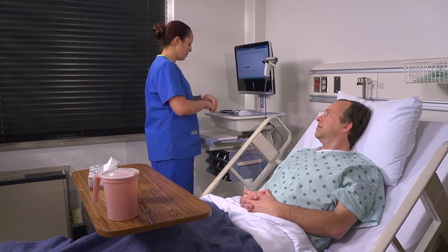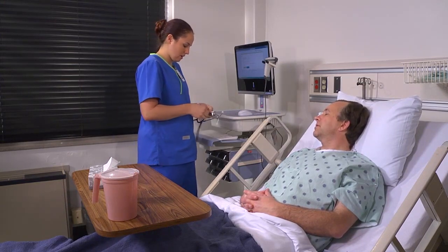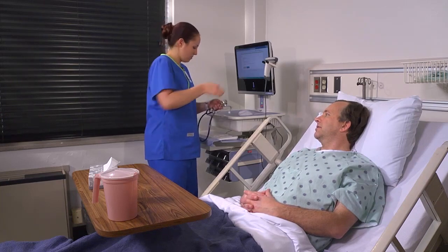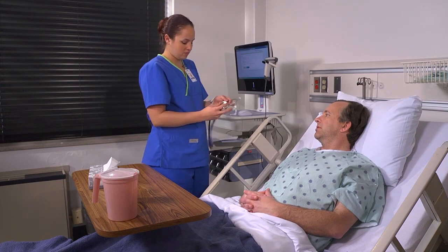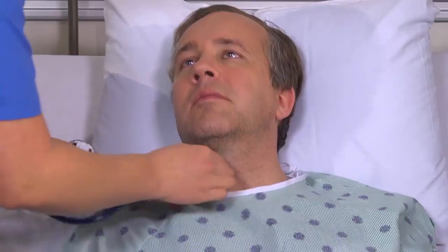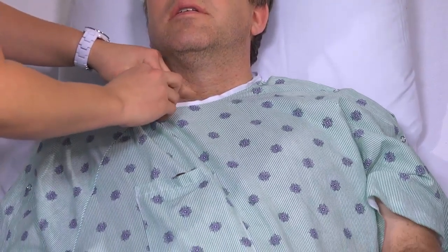Okay, it's been about 30 minutes since you took your medicine, so I'm just going to take a listen to your lungs again, okay? Okay. As part of your follow-up care, assess the patient's respiration and breath sounds, comparing them with the assessment you made before the medication was administered. Note the patient's response to the medication and observe him for adverse effects.